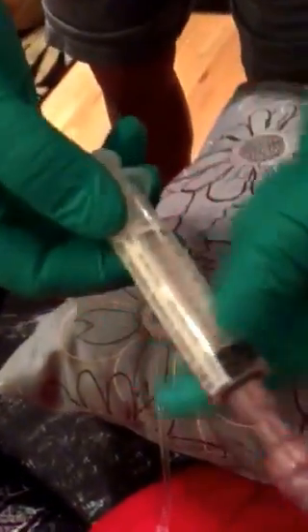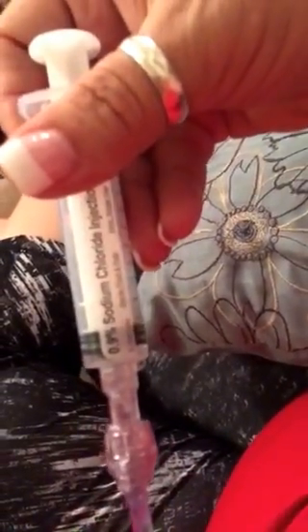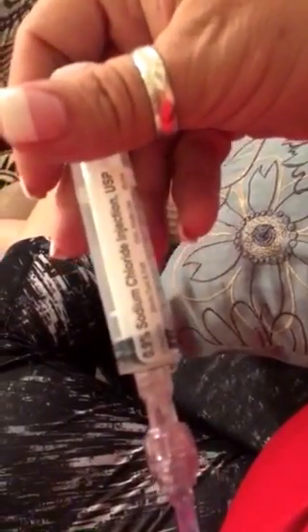He does a little trick where he leaves just a tiny bit in the syringe — the nurse told us that last little bit is actually just air. This is just sodium chloride, and this is what you use to flush.